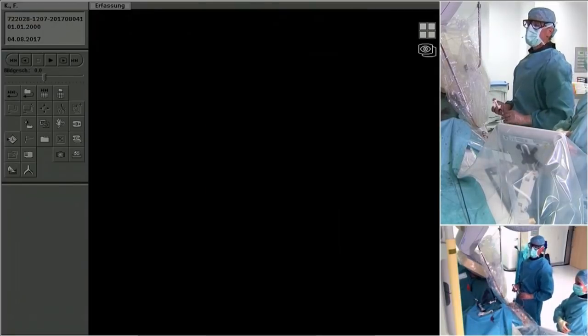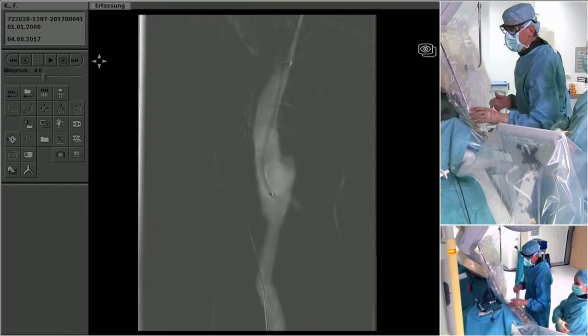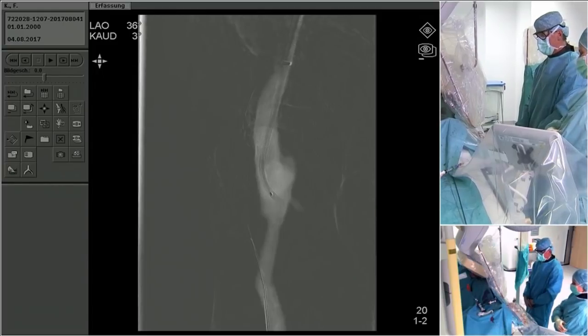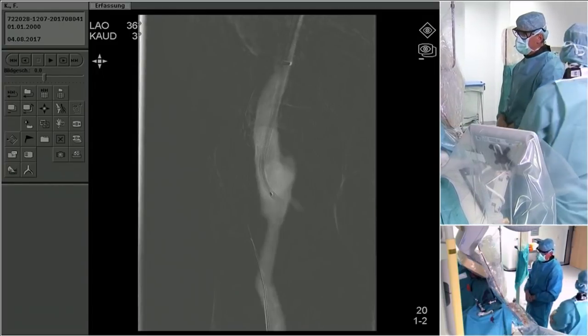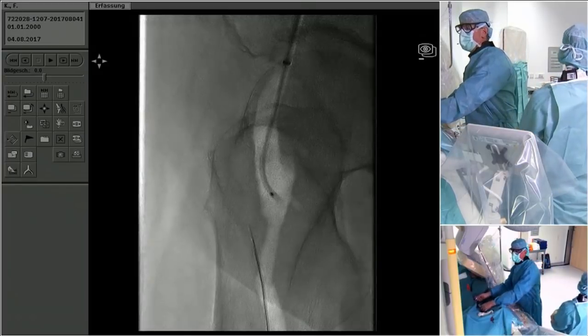How about a snare on top? You give a bigger angle. Sorry? A snare on top to give you a bigger circle to target. Yeah, you can also do this, of course. I think there are many ways to do this.